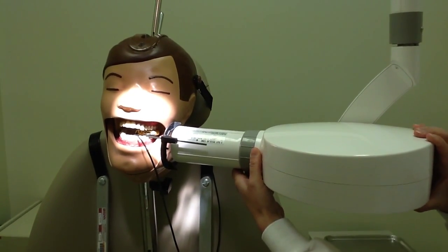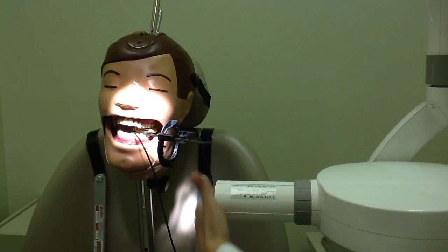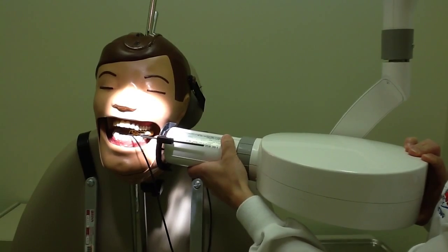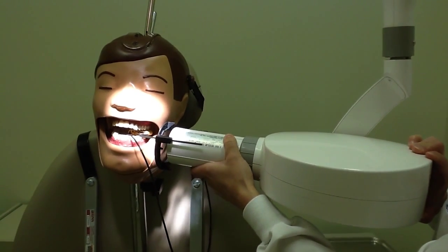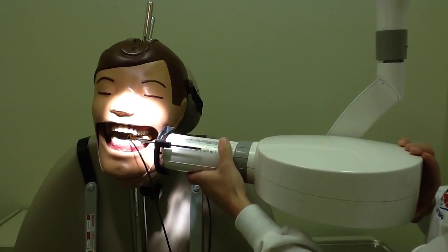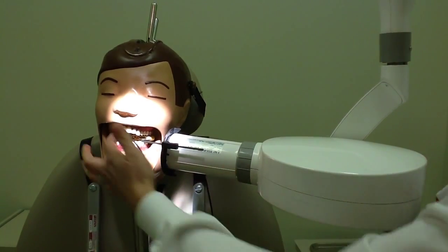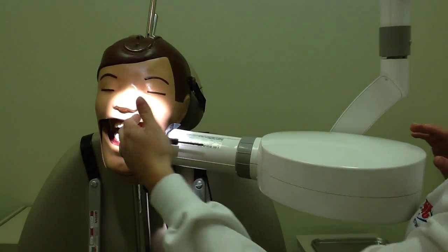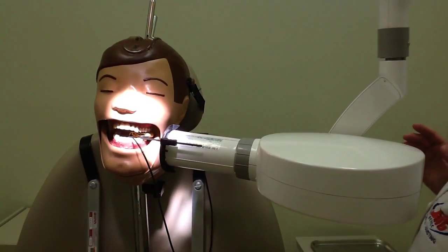We want the face of the PID, what we call the window, to be parallel to this black ring when using an XCP kit. It doesn't have to be touching it. It could be further away, but as long as it's parallel. This is a guide for you. So now that I've lined up the PID parallel to the window, and we've positioned this receptor parallel to the tooth, that's the paralleling technique.